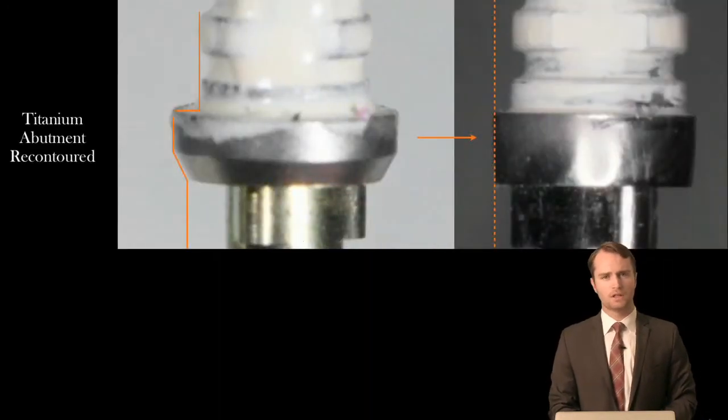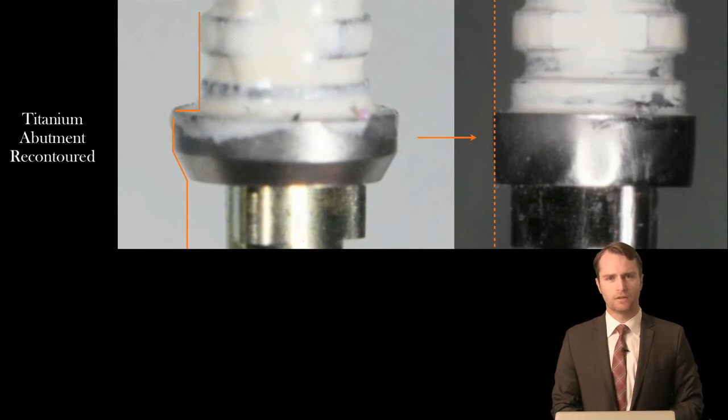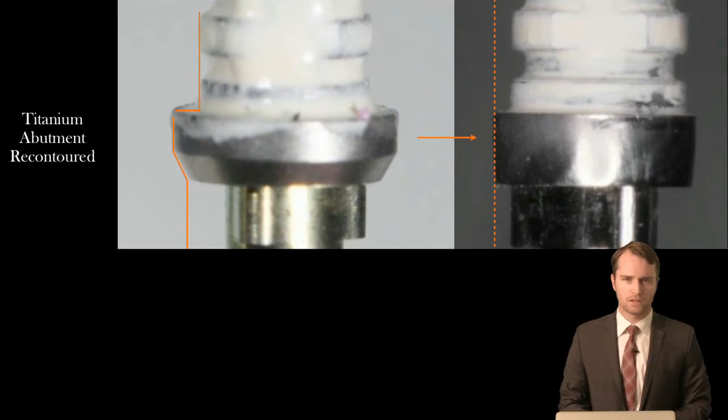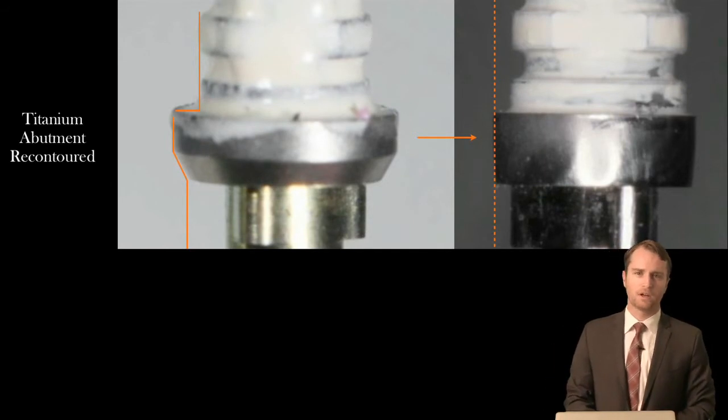We take these abutments and attach them to a protection analog and simply remove the flared portion of that. Our ideal design when doing this is to create a straight profile off the head of the abutment. For some platform-switch design implants like the NobelActive, we have already accomplished this in the provisional abutment stage without having to modify it.